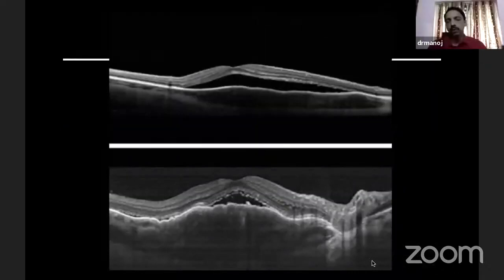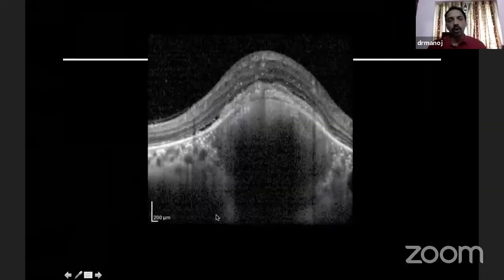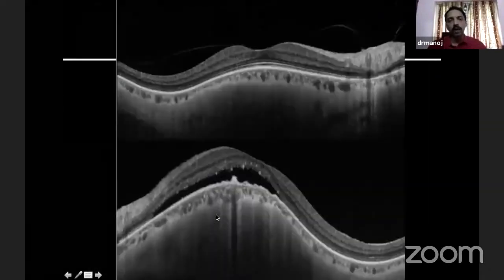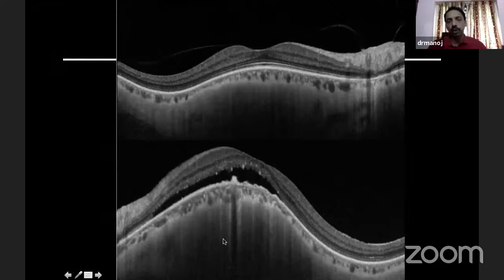These are examples of patients with lymphoma where you see irregularity of the choroidal contour. Sometimes you may confuse it with a choroidal mass, but sometimes the contour is abnormal because of certain inherent defects — like dome-shaped maculopathy that you see in myopia.